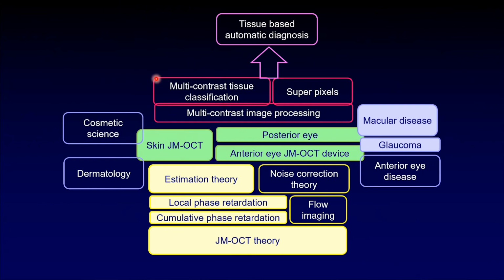Okay, the Jones matrix OCT can provide us really high dimensional signals or images. Now, dimension means a feature dimension. Okay, a single pixel consists of 5-6 contrasts. It's really high dimensional information. We need to properly, newly design the signal and image processing method for this kind of set of images or high dimensional images. We call it a high dimensional image.